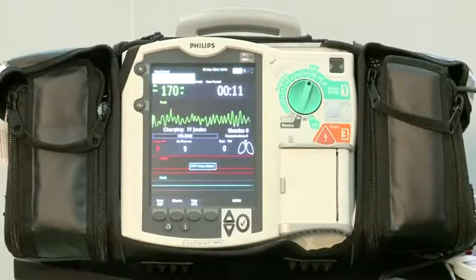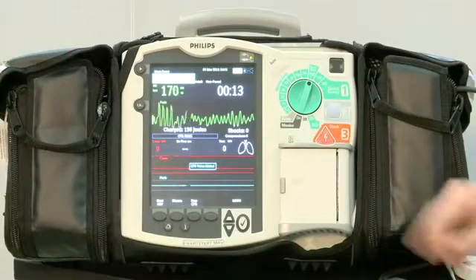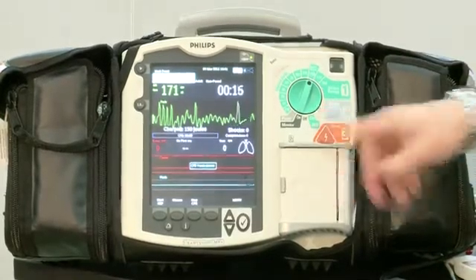Simply charging the device to 150 joules takes four seconds. Clearing, making sure the scene is clear, then delivering the defib shock.